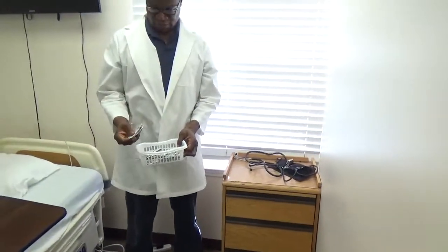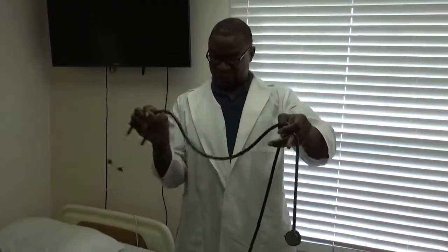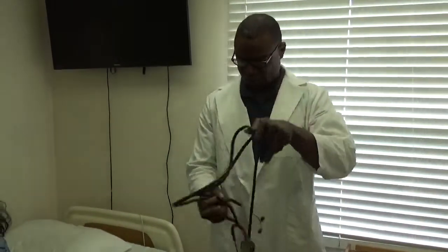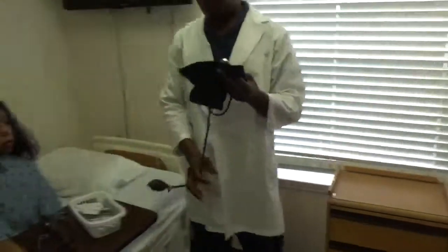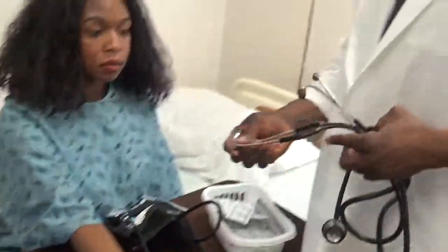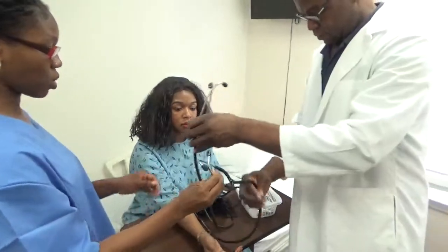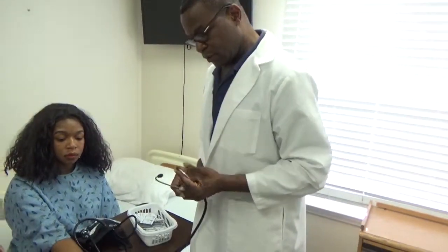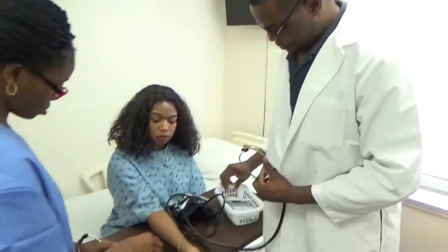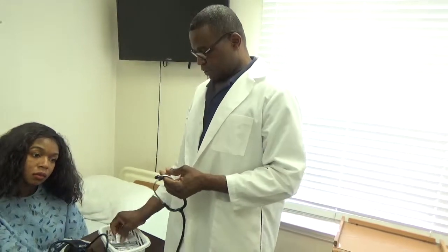Your blood pressure supply equipment will be here. You will need alcohol wipes and a dual stethoscope — so one end the instructor will listen and the student listens on the other — and then the blood pressure cuff. The first thing you are going to do: if the examiner does not wipe the stethoscope, then you need to wipe it. Wipe yours first, making sure they don't get twisted. Use one alcohol wipe per earpiece, because several people use the stethoscope.